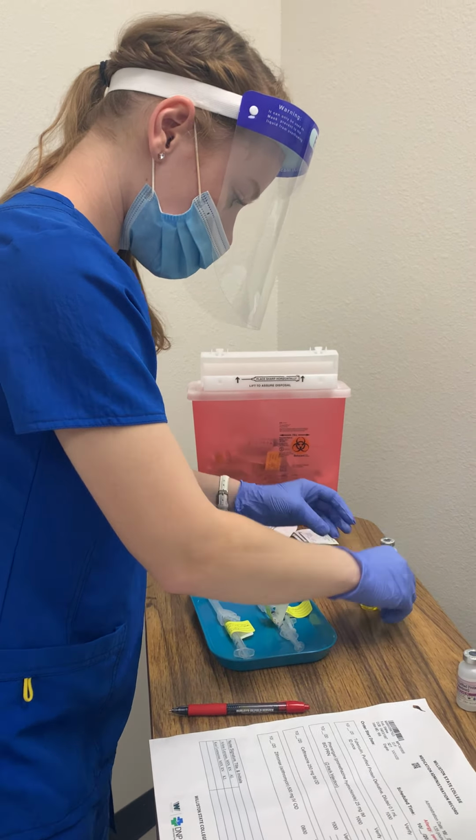Make sure I get it all dry so I have no sticky gloves. And then I'm gonna go to my patient's room. So, hi Shirley. Hi, how are you doing today? Doing okay? Good. Okay, so I'm just gonna put on some gloves.